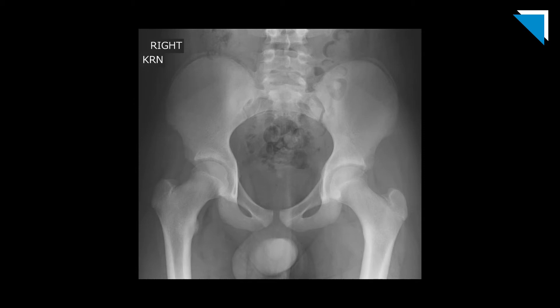This is a good opportunity to review some of the most common pelvic avulsion injuries. It's very important to make all of these landmarks part of your normal search pattern when reviewing pelvic radiographs. This is the full AP radiograph from the patient we just discussed, showing the sartorius injury at the anterior superior iliac spine. Just inferior to the sartorius origin is the origin of the rectus femoris at the anterior inferior iliac spine.